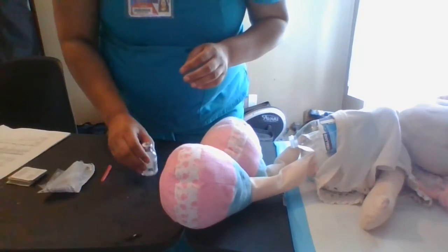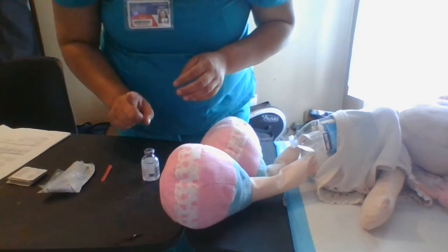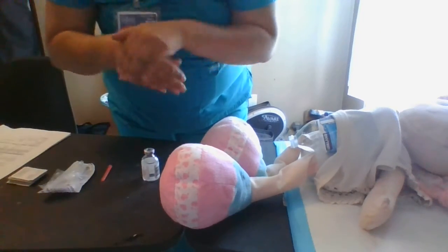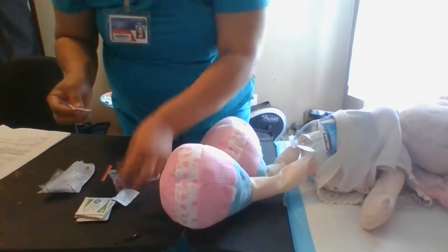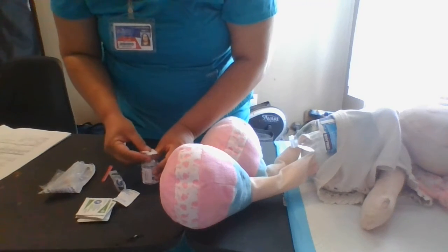The label on my heparin reads 5,000 units per mil, so I will be drawing up 1 mil. Hand hygiene. I will clean for 15 seconds.